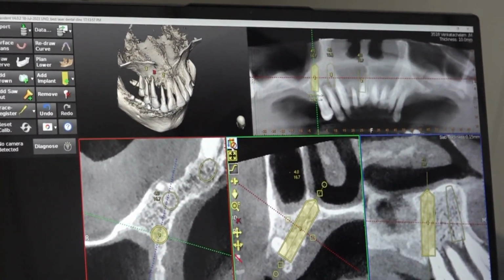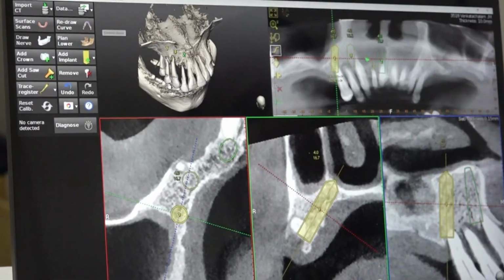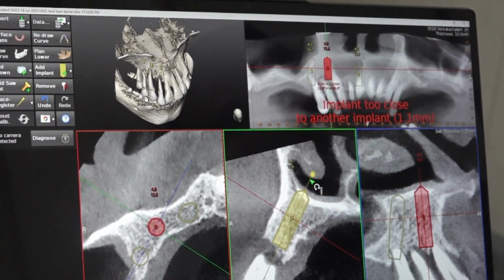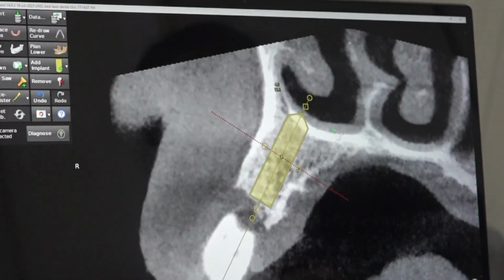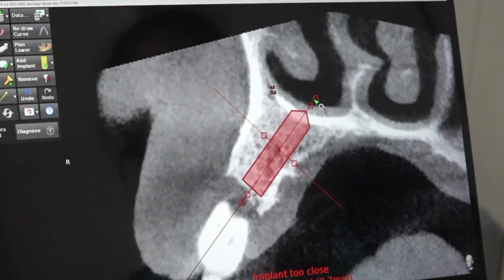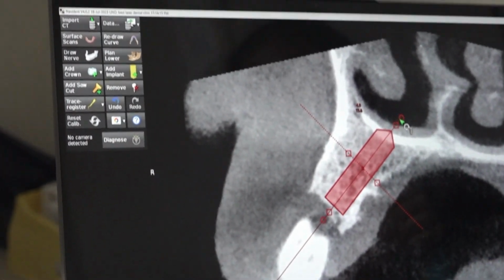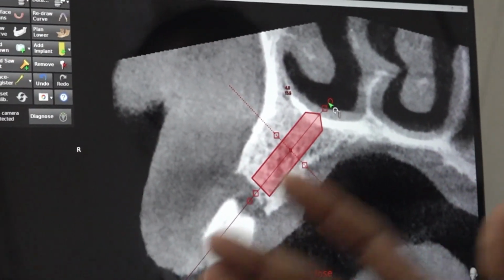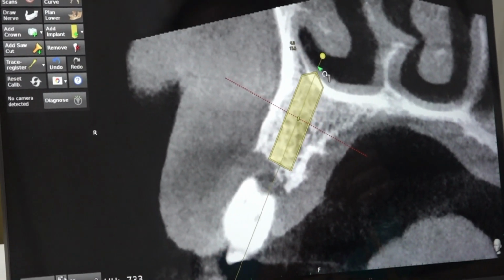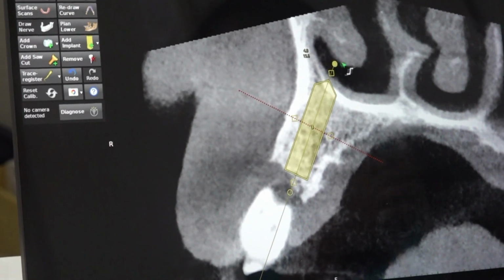So this second premolar implant is palatally tilted. What you can do is the first premolar implant you can tilt towards the labial. You can see immediately it becomes yellow. So if you go palatally, it is closer, because that implant is also palatal. The previous implant is also palatal, and the one implant is also palatal. So that is why you can go not mesial, buccal, yes, labially.